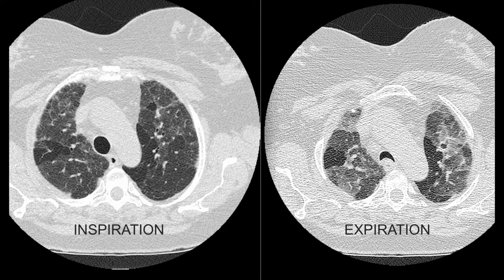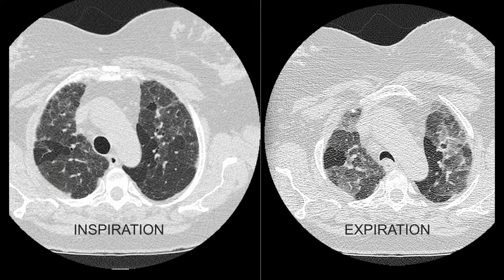This is a case of hypersensitivity pneumonitis. Note on expiration, the posterior tracheal wall falls inwards because it does not have a cartilage skeleton. During expiration, the diameter of the trachea reduces and the posterior wall falls in. The black area — the area of mosaic reduced attenuation — is exacerbated during expiration, whereas the normal lung density tends to become more grey during expiration.